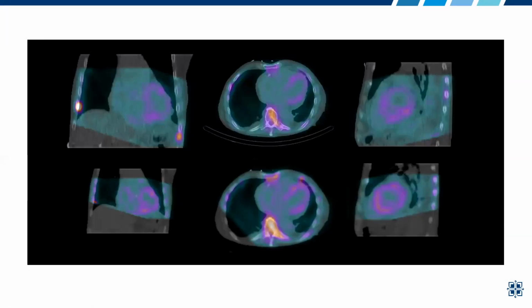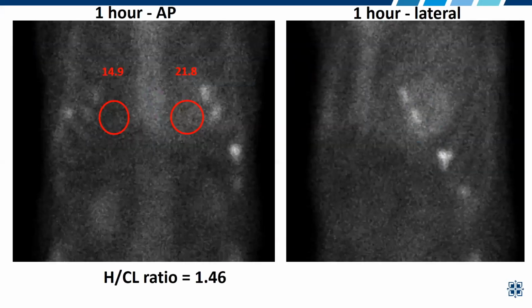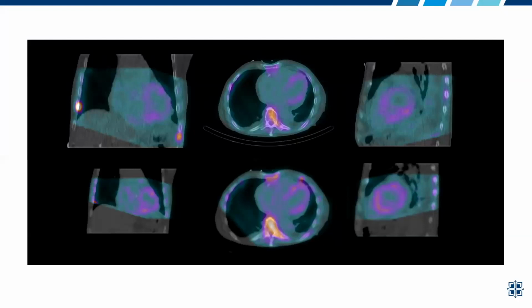Eric, thoughts about this case with respect to the rib fractures and the scaling? I mean, it's kind of what we've been speaking about with the prior cases as well, and the points that we really want to hammer home there. But any additional thoughts on this one?